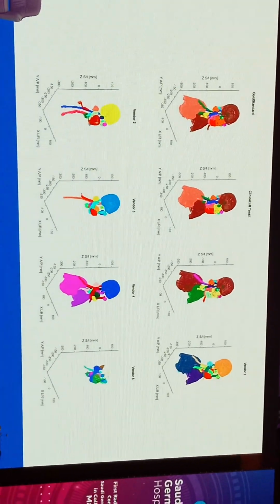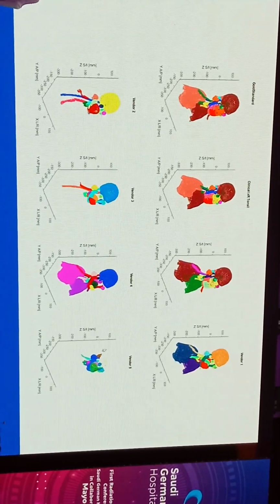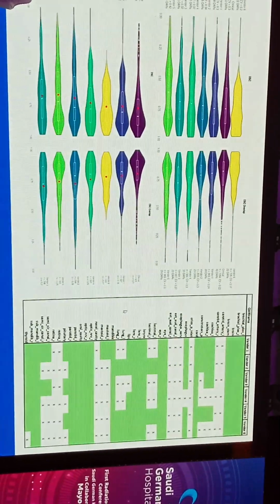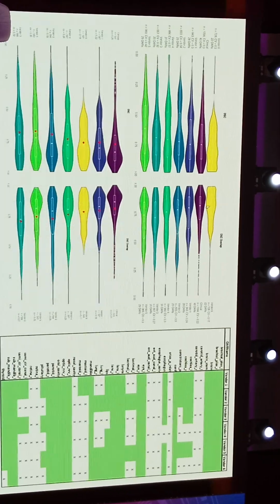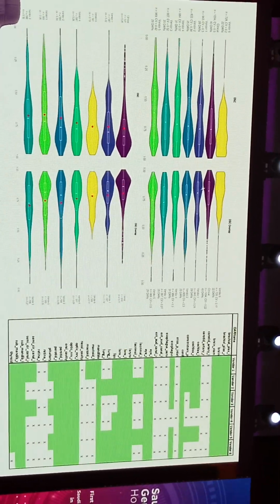And we use that as reference criteria to compare various vendors. And what we saw was that many of the vendors performed at or near the clinical acceptability.